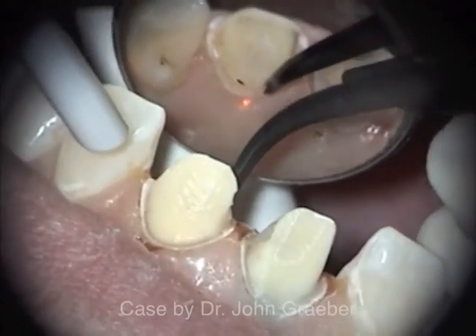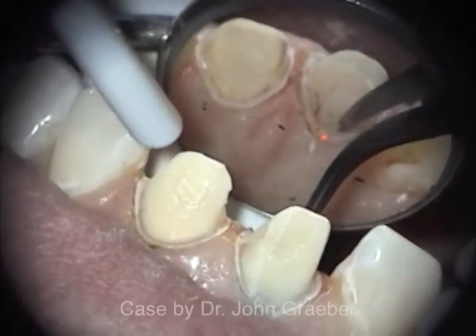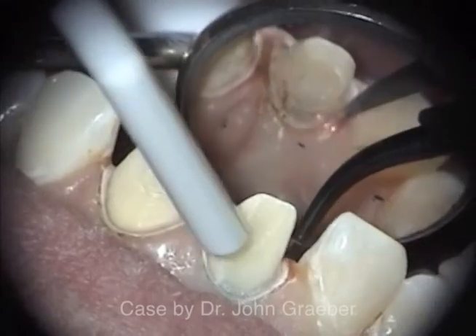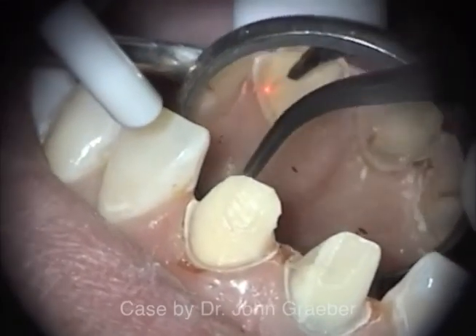Proper technique can easily control hemorrhage and gingival crevicular fluid, making impressioning easier and more predictable than traditional retraction techniques.